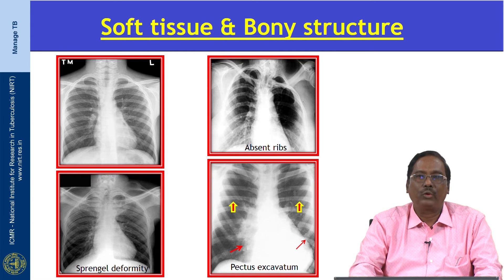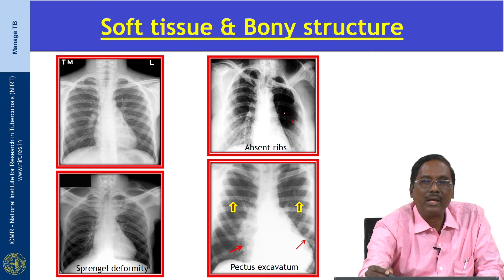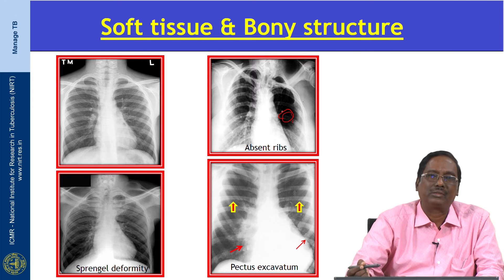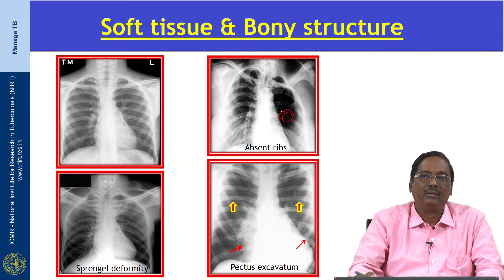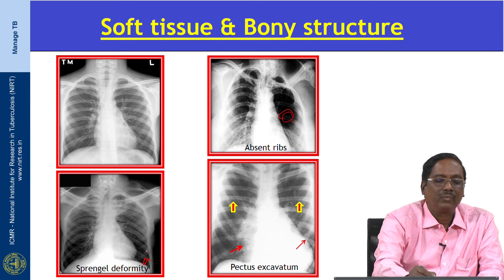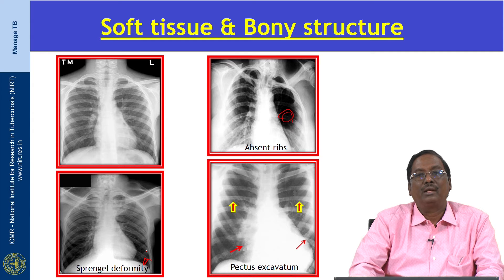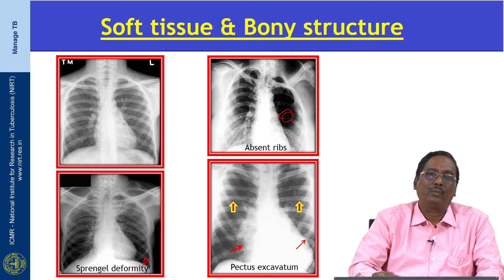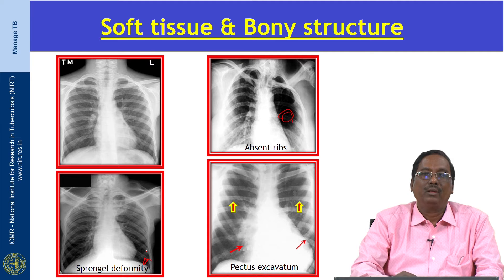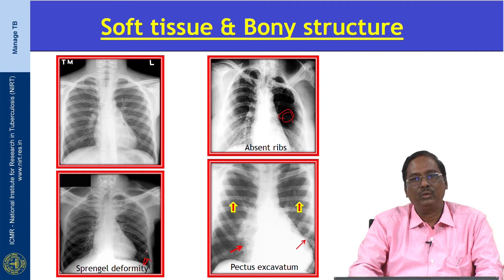This X-ray shows missing ribs, and the clavicle is also missing. This is a patient with Sprengel's deformity, where the scapula is placed in a higher position — a congenital problem. X-ray can detect the abnormality; however, MRI is very useful to confirm the extent of pathology.